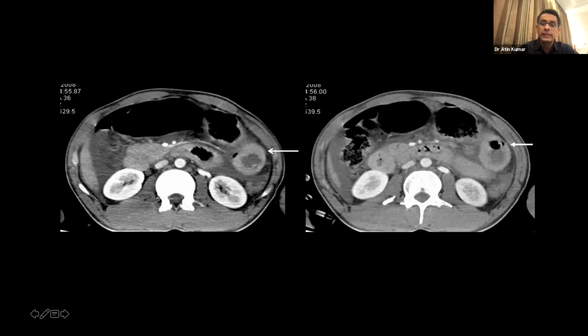Most often what we see is pneumoperitoneum and focal bowel wall thickening, or maybe some diffuse bowel wall thickening without a focal bowel wall discontinuity. We just say that there is most likely a bowel injury, and depending upon which bowel loop is showing slight thickening, we may say that most likely some ileal loop or maybe a proximal jejunal loop is the bowel most likely to be injured.